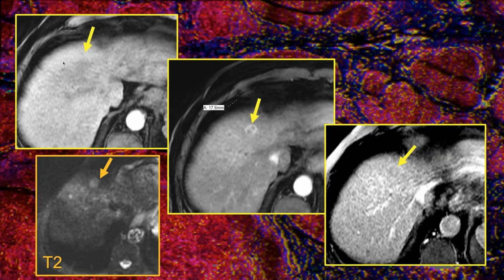So if we go to the middle image where we have measurement, we see hyper-enhancement, and the bottom right, we see washout. And I will admit that this was categorized as LI-RADS 5, but I think some of you realize, whoa, that shouldn't be, it's targetoid. So indeed, it's most appropriate to be on the lookout for targetoid and other features for LI-RADS M, because this has different management implications. Rather than go straight to treatment for hepatocellular cancer, indeed, this went to biopsy and was cholangiocarcinoma.